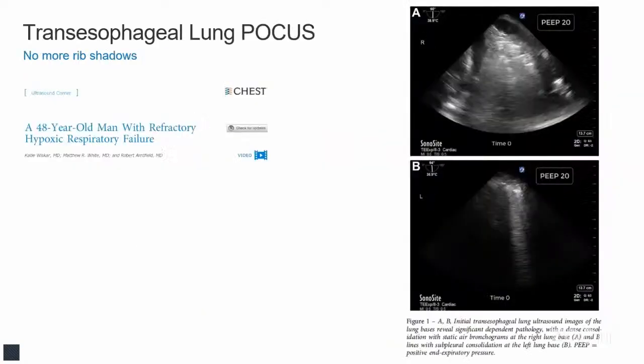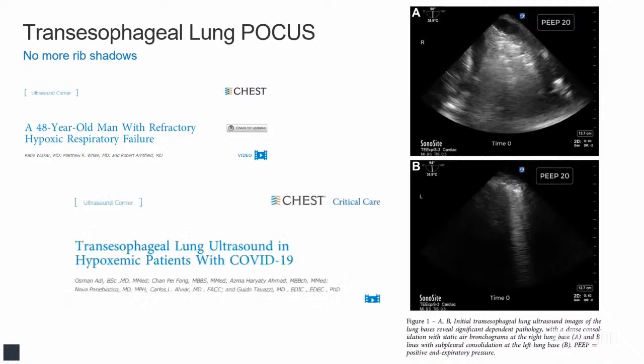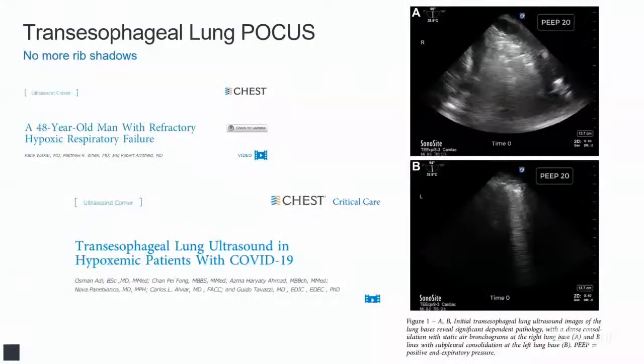When it comes to the even more advanced cases, if you already have a transesophageal probe in the chest, they were able to show that by doing so they could identify a PE or a patient with refractory atelectasis while in the TEE suite.